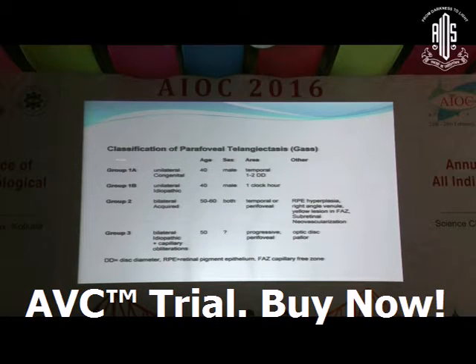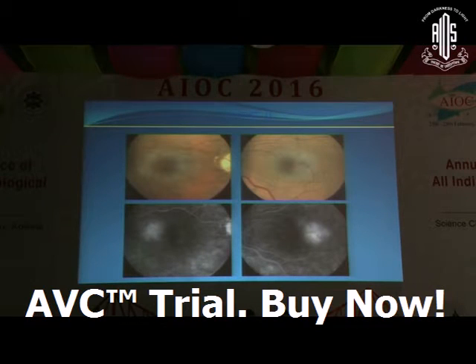It can be classified into group 1A, group 1B, group 2 and 3. What we see is group 2 and group 3. Here is another example of IJT, or idiopathic juxtafoveal telangiectasia. You can see a grayish lesion temporal to the fovea. On fluorescein angiography, what you see leaks in the late phase.